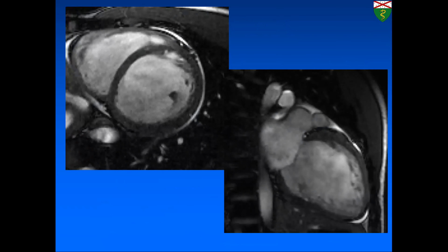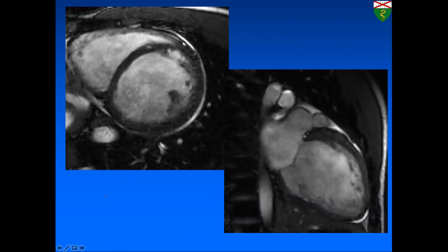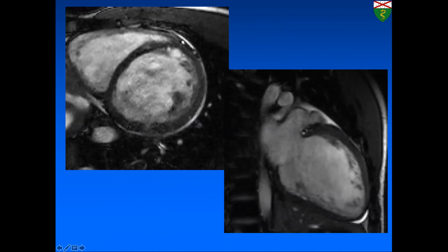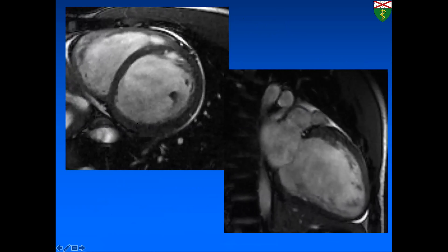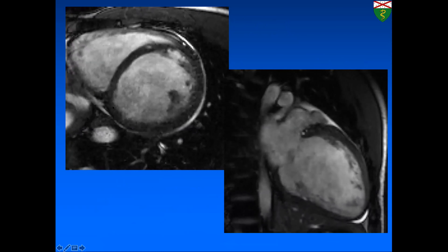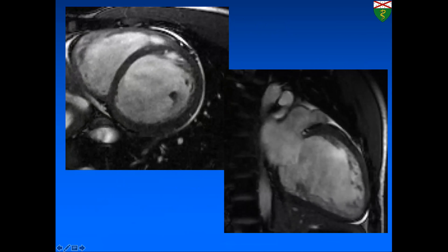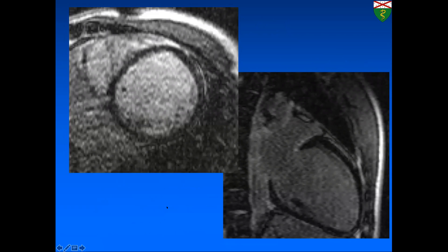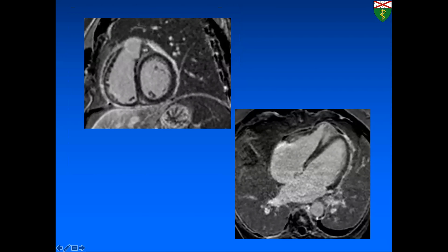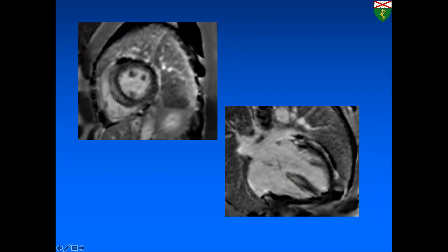This patient with dilated cardiomyopathy shows a dilated left ventricle, dilated right ventricle, and very severely depressed systolic function on short axis and two-chamber views. The late enhancement is normal, which is the most common finding — this was alcohol-related dilated cardiomyopathy. In another patient, you can see the classic mid-myocardial delayed enhancement in the septum, which is real at mid-ventricle level. It can also be more mid-wall to epicardial in location. Research published in JACC Cardiovascular Imaging showed that in dilated cardiomyopathy, the presence of septal LGE is associated with increased risk of death, and the risk is greatest when both the septal wall and free wall are involved.